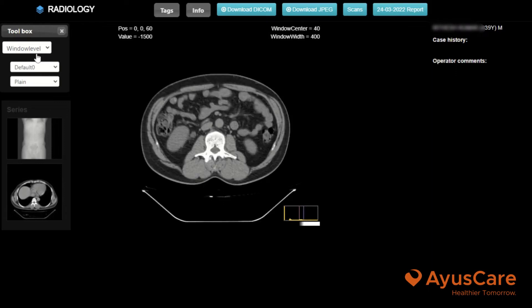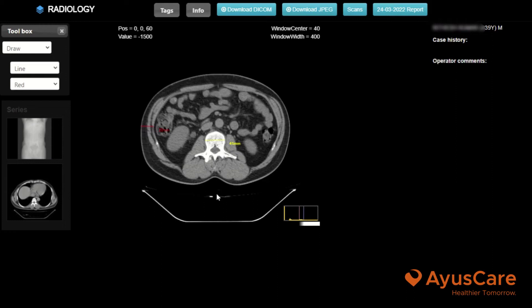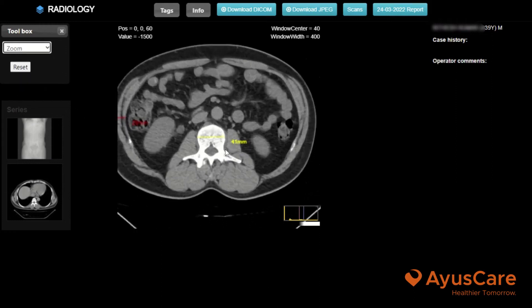Other than that, you have draw level. In the draw, you can go with circle, line, rectangle, or something. You can use different colouring options to check it out. In the zoom level, you can zoom.